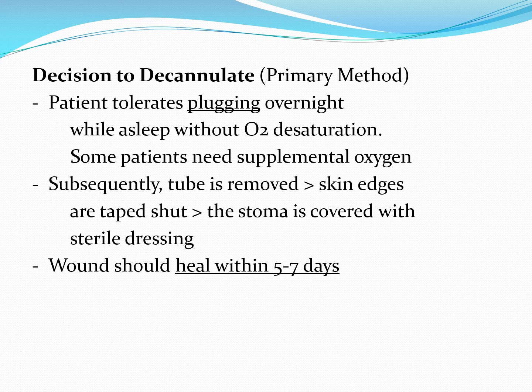Subsequently, the tube is removed, and the skin is taped shut. In some cases it is, in some cases you just have gauze, you have tape, and you just tape over the stoma and encourage the patient not to speak, and when they do speak, to put their hand over that gauze to try to minimize any air from escaping. And the wound will heal in 5 to 7 days, 5 to 10 days, something along those lines. About 90% of them will heal within that time frame.